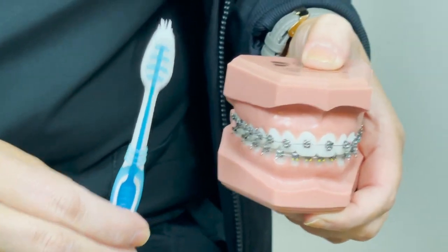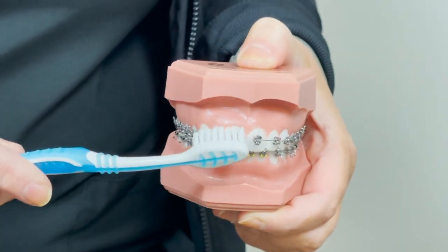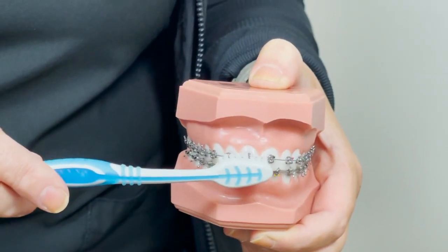Hi, it's Maida with Whitlock Orthodontics here, and I'm going to go over quickly how to properly brush your teeth with braces. It doesn't matter what kind of toothbrush you're using, whether it's manual or automatic — you're going to brush your teeth as you normally do: go back and forth, round in circles.